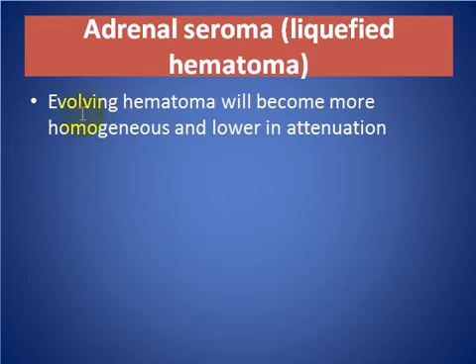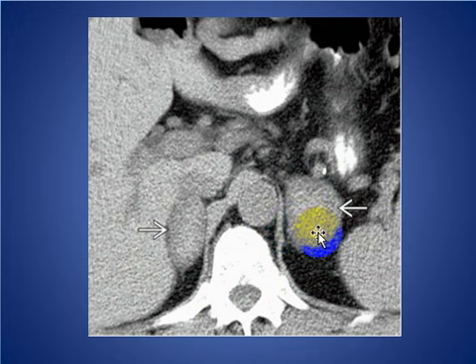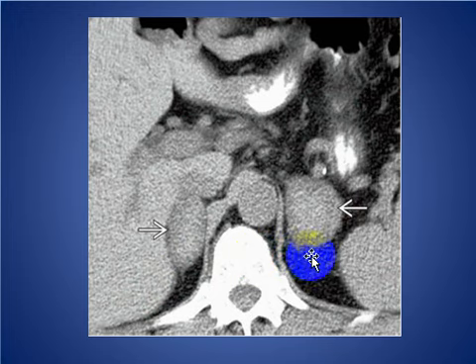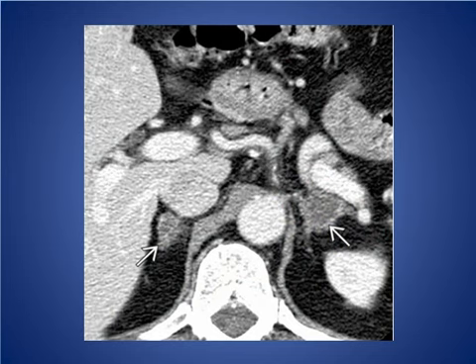Adrenal seroma: a liquefied evolving hematoma will become more homogeneous and lower in attenuation. Here we see a patient with bilateral adrenal seromas on non-contrast CT — heterogeneous high-attenuation masses in the adrenal glands due to adrenal hemorrhage. These evolved into water-density seromas in the same patient after 12 weeks.